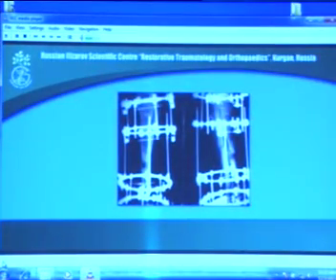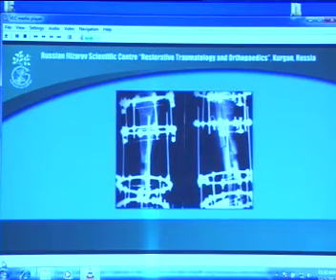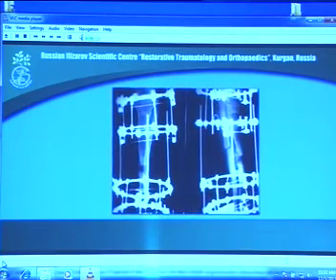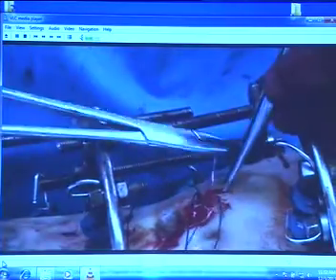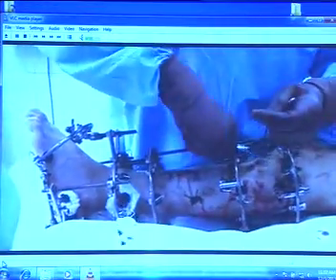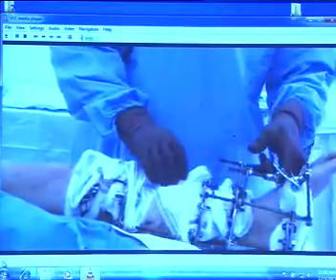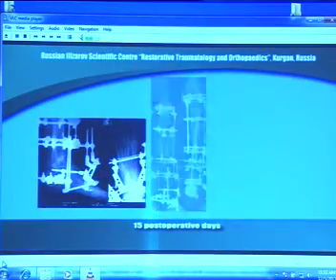Radiographs show osteotomy and realignment achieved. A 2 cm bone defect is formed with bone ends being congruent. Skin stitches are used and an aseptic dressing is applied. Patient's radiographs during treatment.